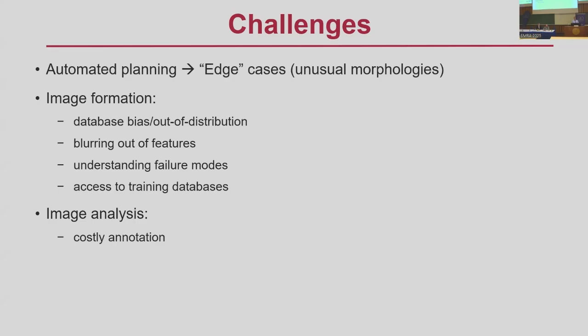Annotation is more costly, so generalizability is something that people are working on. Multi-vendor, multi-site, you want things to be able to work out of the box. You can see that this is a general problem across all the tasks. And interpretability, which was also mentioned in the last talk, is something important: we want to understand why those decisions are made by our model.